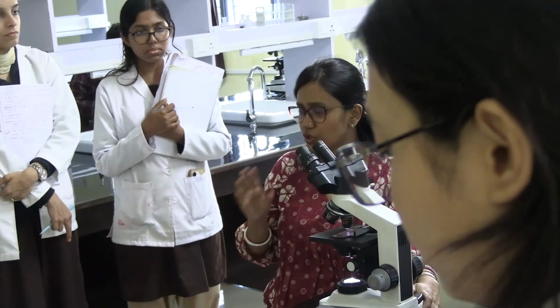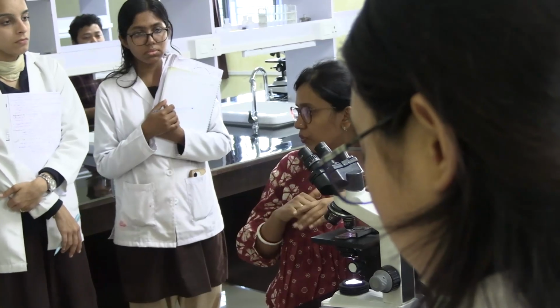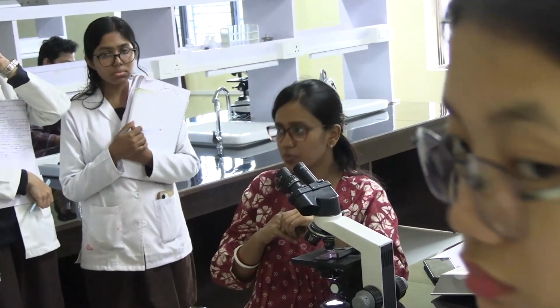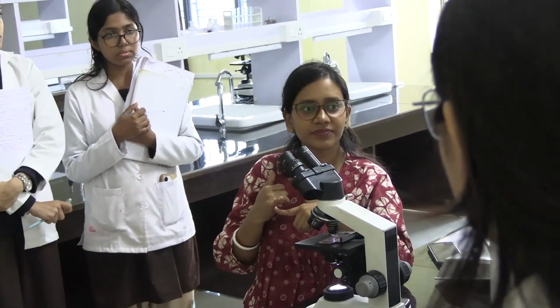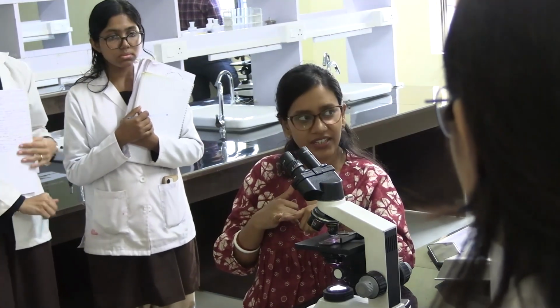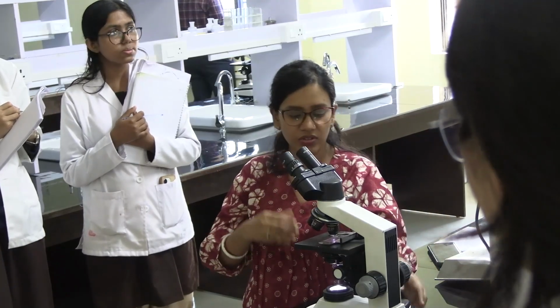So these tumor cells are seen arranged in glands which are invading into the submucosa, and these glands are lined by tumor cells which have features, tell me, showing nuclear pleomorphism with increased NC ratio and hyperchromatic nucleus, okay?